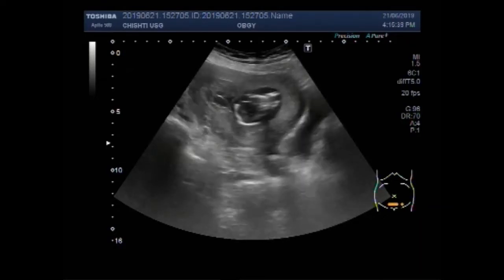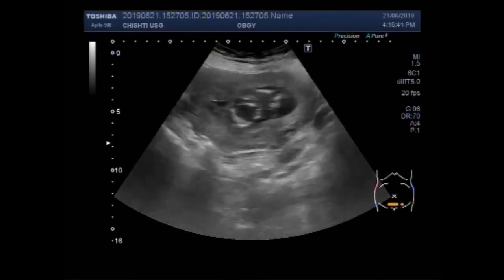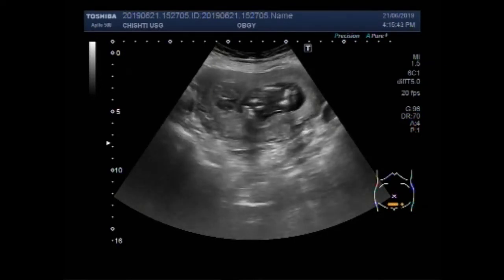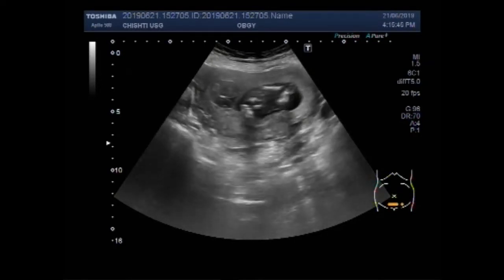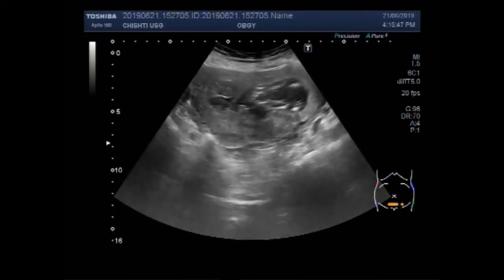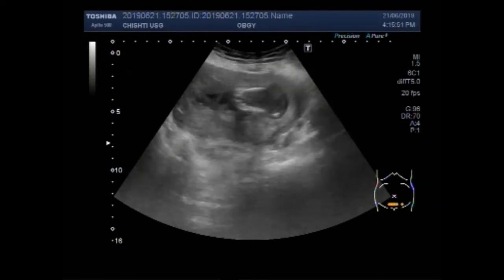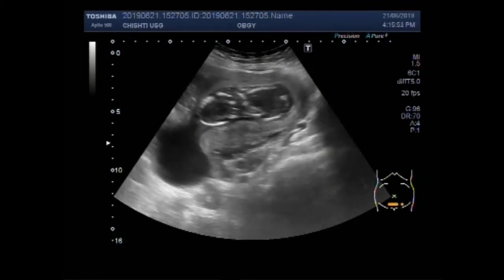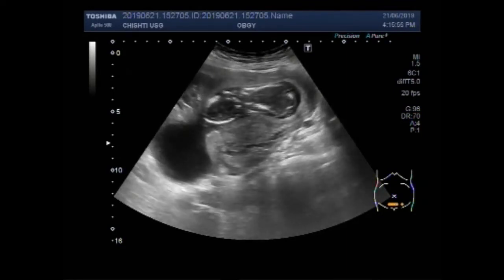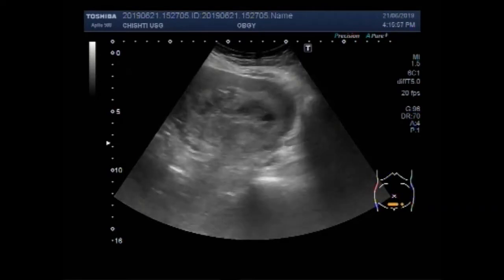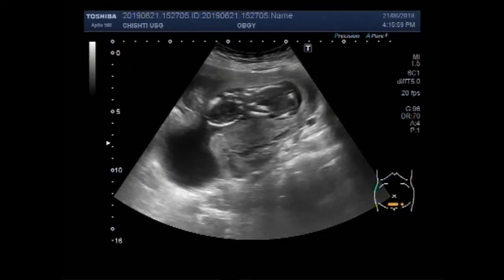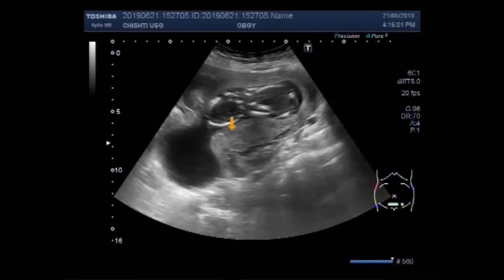The cyst measures about 5.5 cm by 5.8 cm. Now you can see the urinary bladder, ovarian cyst, fetus, and the mass in the anterior wall of the uterus. Again, this is the placenta — a small placenta. This is the fetus.